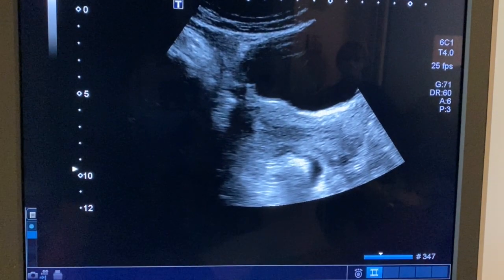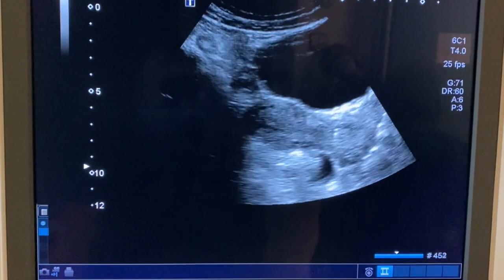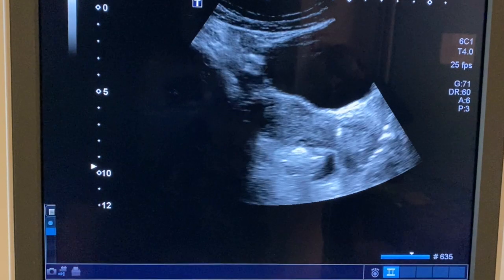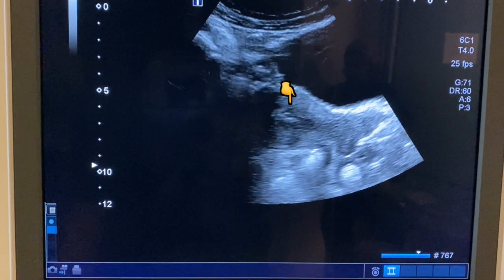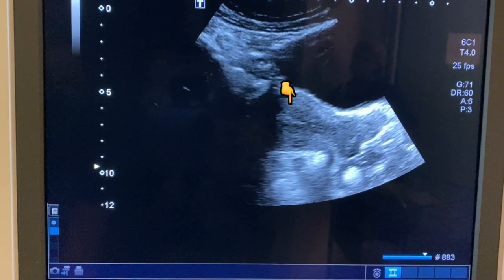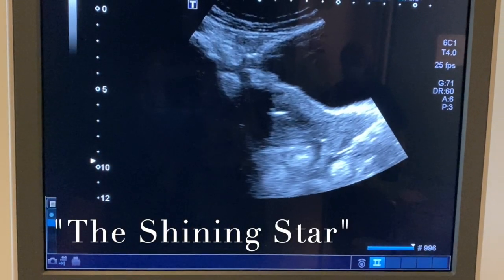This is a good scan as we can see the lining very clearly, which is where we are aiming to place the embryo gently in that perfect position. The next thing is we place the outer catheter to get ready for the inner soft straw for the embryologist to bring to us to put the embryo, again aiming for the endometrium in the middle there, the perfect place for the embryo to live in. Here we go, the inner soft straw going in, and gently we're going to place the embryo in there. Wait for it. Here we go. Our shining star hopefully sticks in there, grows into a strong and healthy baby for us.